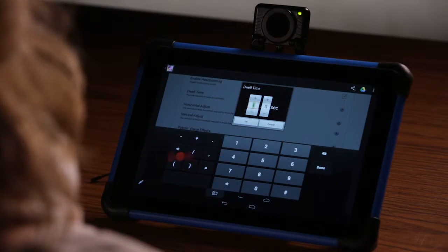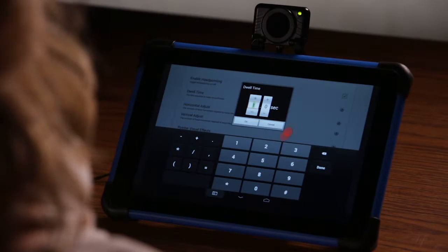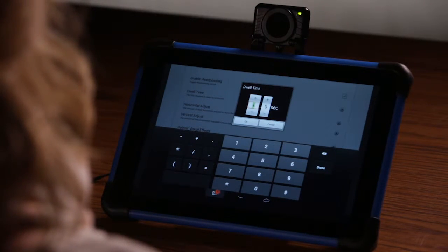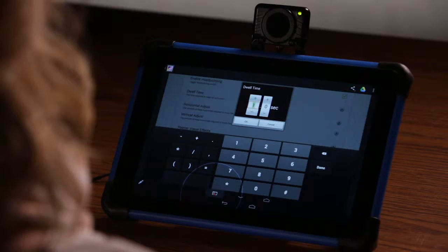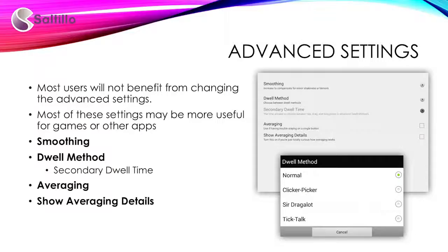The first clock, in a gray outline, activates the button. Once the second clock with a black outline starts, then it activates just like Direct Select. If you move off at the start of the spin, then it drags. If you hold further into the spin, or a dwell, then it activates a push and hold.